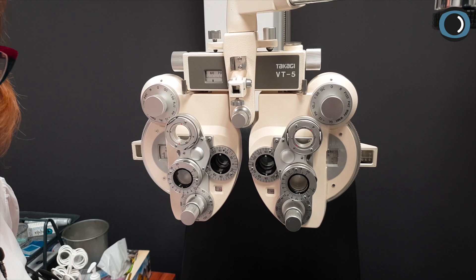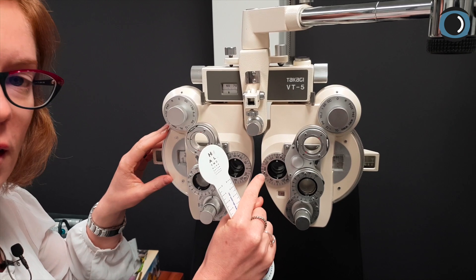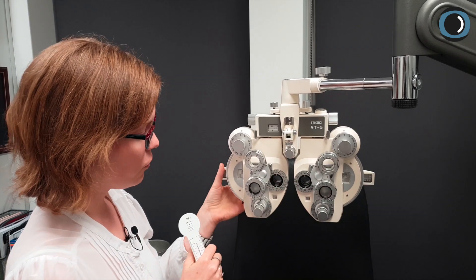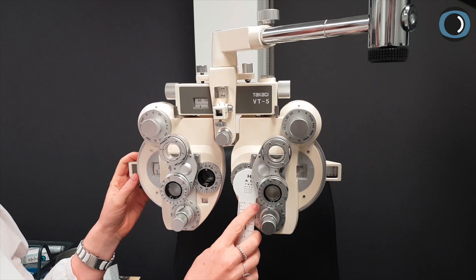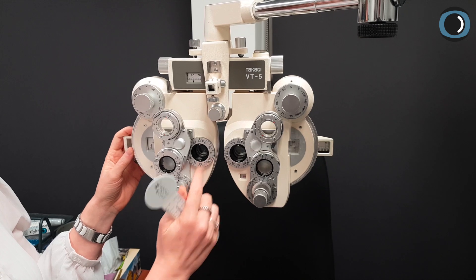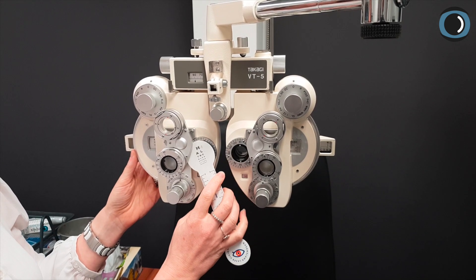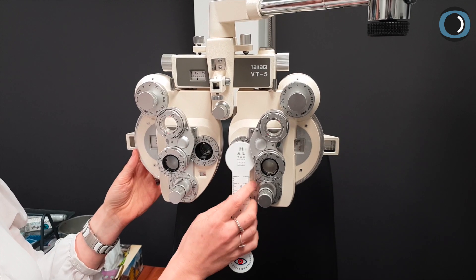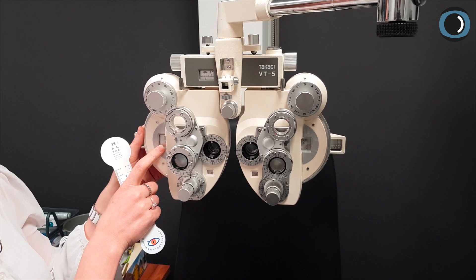What if that doesn't quite go to plan? The way to manage that is to keep adding plus until you make them prefer the other eye, take that last step out, and then balance the other eye. Let's say we've added plus 0.25 to Mr. Invisible's right eye and he says they're pretty similar, or still prefers his right eye. Give him another plus 0.25. Still not sure — maybe his right eye. Give a bit more plus. Now he prefers his left — take out that last plus 0.25 step.